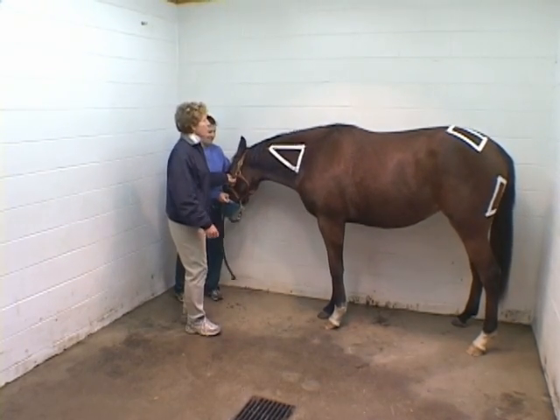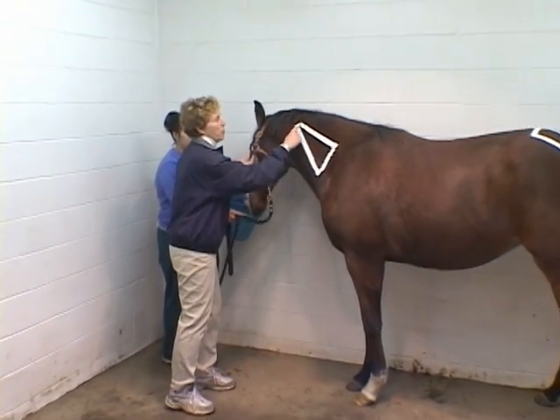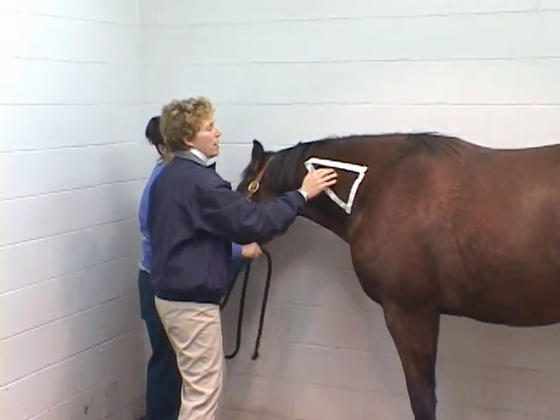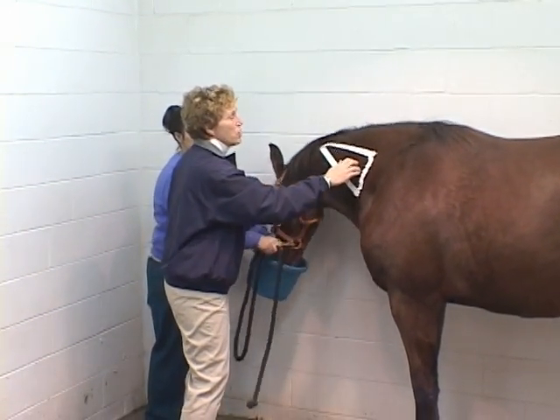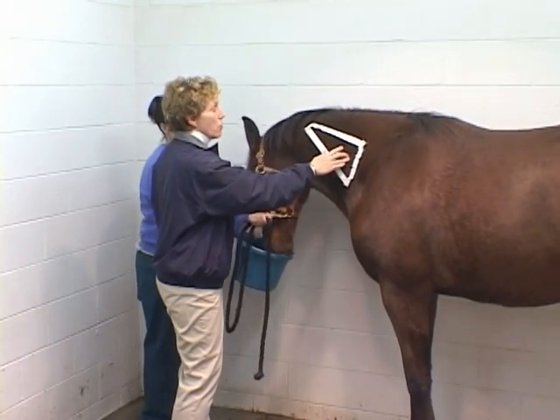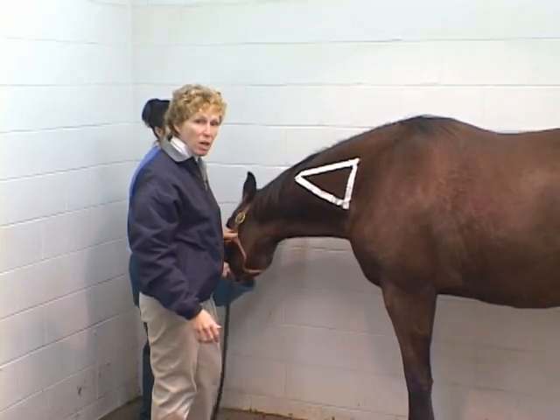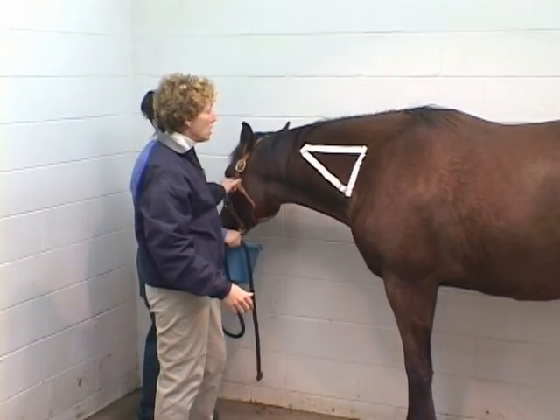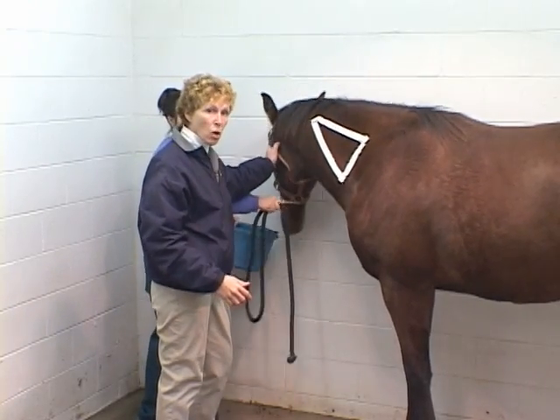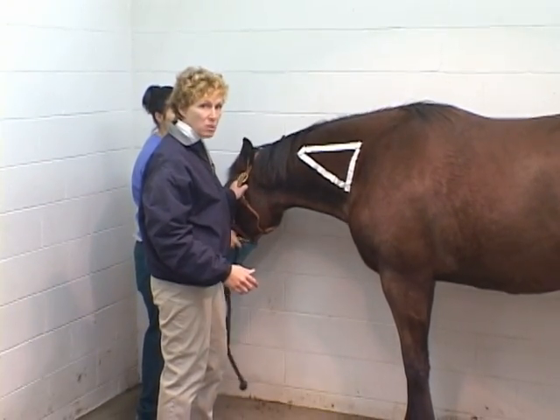If you look here on her neck, right here in front of the scapula, below the nuchal ligament, and above the spine, you have this triangle right in here, which is a really good, safe place to give an intramuscular injection. The good news about giving an IM injection here is you're in a relatively safe location in relationship to your patient, so you're up at the front end, and you could even potentially give an injection all by yourself, hanging on to the horse and giving the injection.